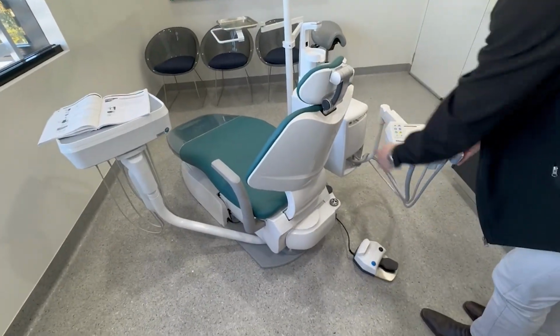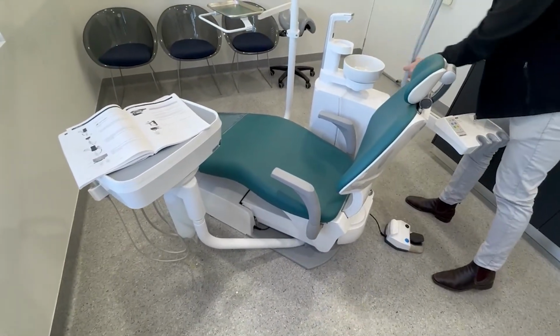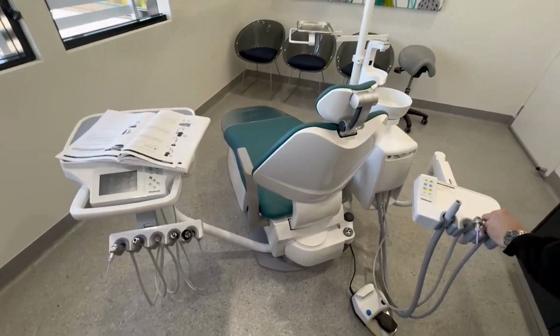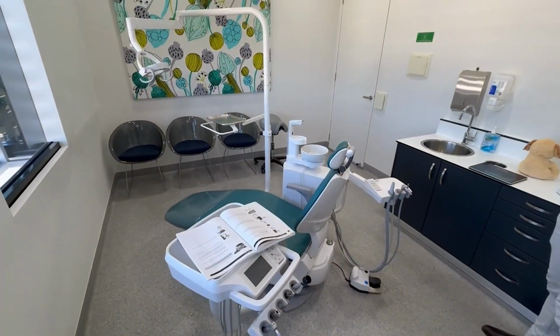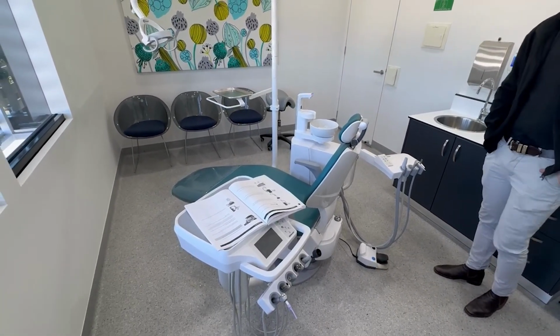So look, it's not a change you're going to be doing all the time. The doctor's tray here will also just come around into position as per normal, and we're back ready to go. So it's a fairly quick, seamless transition once you get used to those motions, and it's not something you'll be doing between every patient.